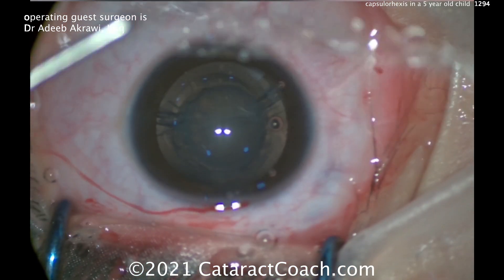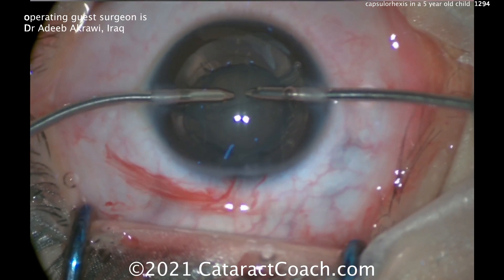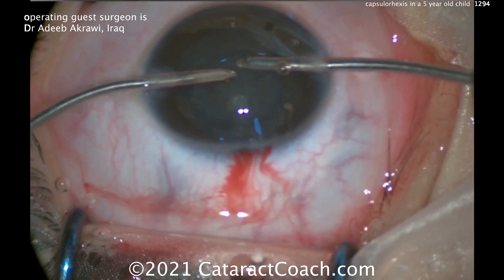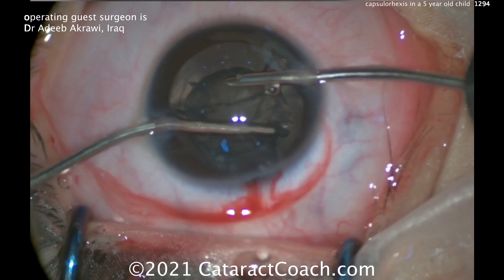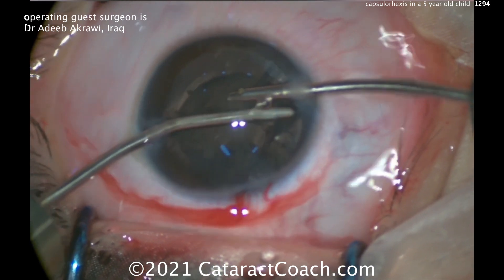Like he did here, you can have a beautiful result. Now this lens is very soft — bimanual I/A will be enough. You'll just aspirate this whole lens down; it'll come down very easily. Certainly this cataract needed to be treated, especially because it was very visually significant. You can see the lens nucleus is just butter soft and comes out with bimanual irrigation-aspiration only.